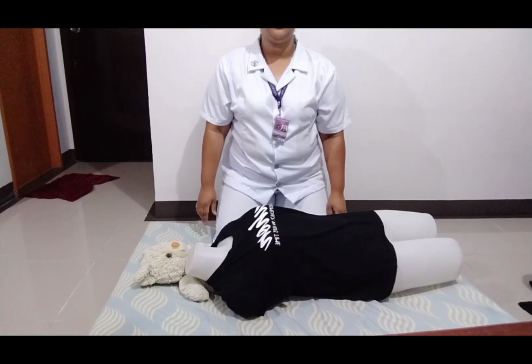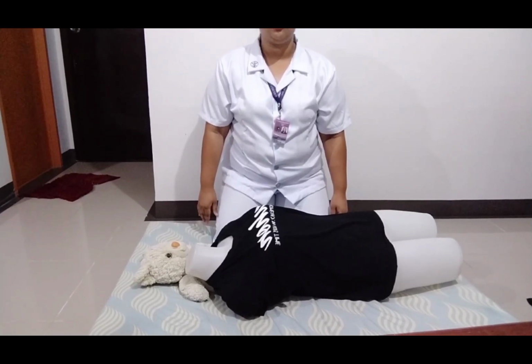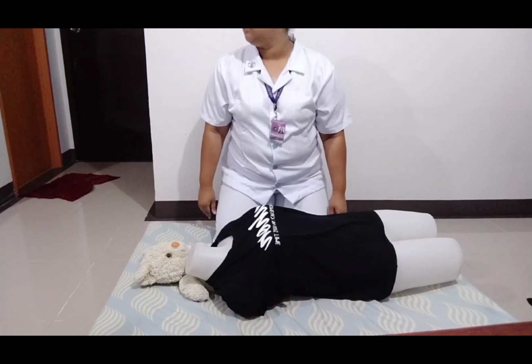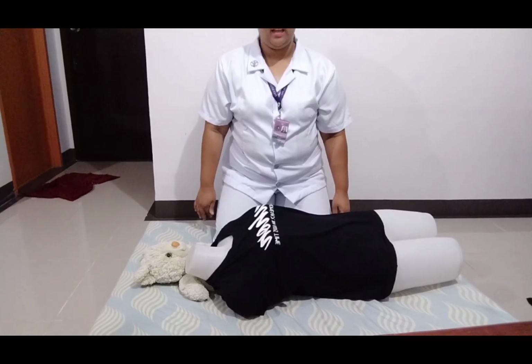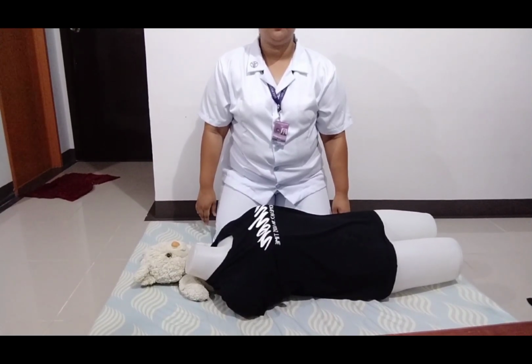Now, I'm going to perform the adult cardiopulmonary resuscitation and AED skills. First, I am going to begin with the assessment and activation. So, I arrive at the scene and I see that the patient appears to be unconscious. The first thing that I am going to do is to scan the area, left to right, up and down. Check the environment for any hazard present.